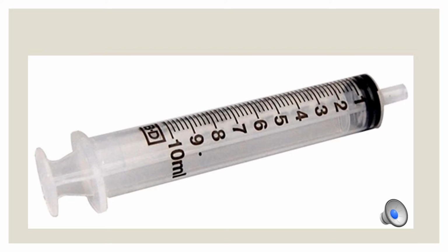Okay, now we have a 10 mL syringe, and with each mL you have 5 lines. Our equation is seconds over lines, and I'm looking it up as I talk to you. Morphine, we're going to give 4 milligrams, and it's available in 1 mL. So morphine, your textbook, sorry, I forgot to flip to the page before I started recording.